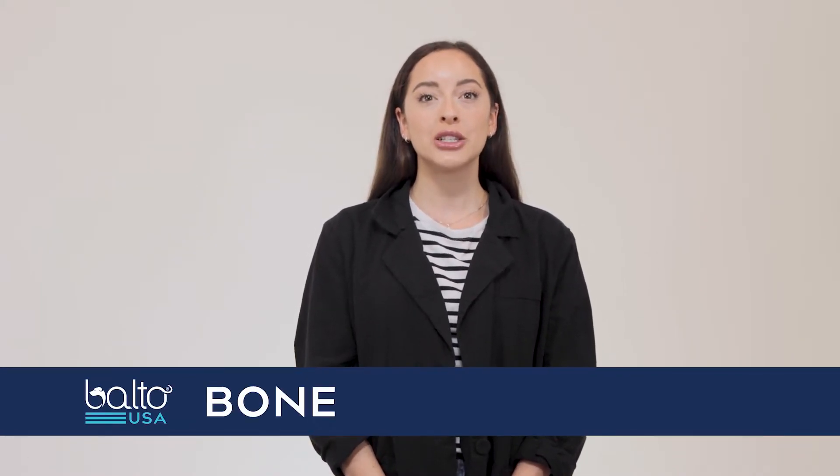Hello, my name is Tess and I'm here with Balto USA. Today we're going to discuss one of our more versatile braces, the Balto Bone Fracture Brace. The Balto Bone is primarily used as an alternative to common splints and casts that treat fractures in the front leg or injuries to the radius, ulna, or carpus.